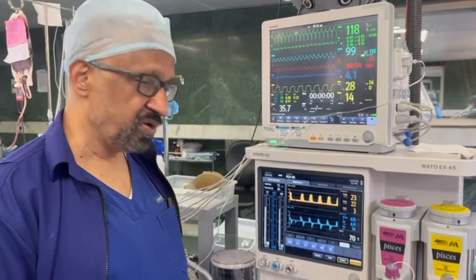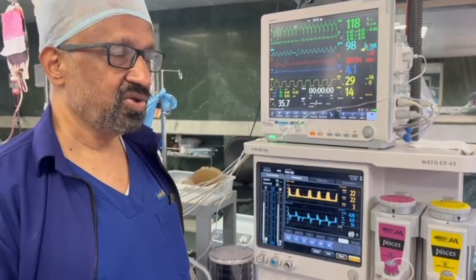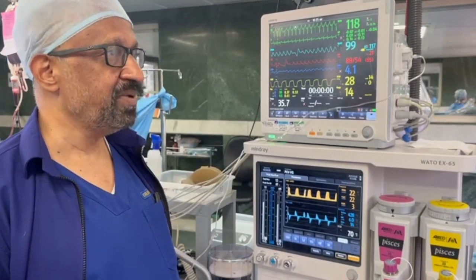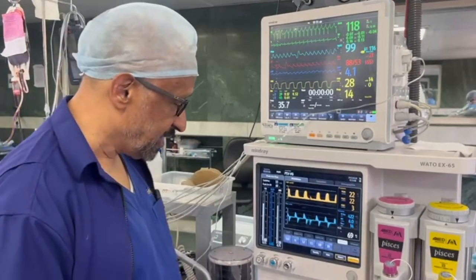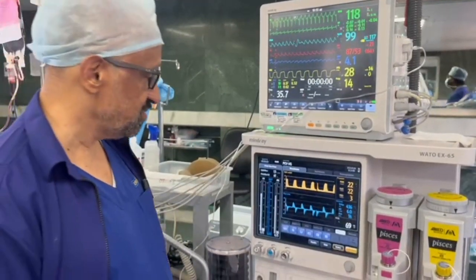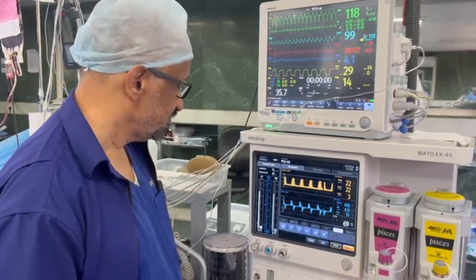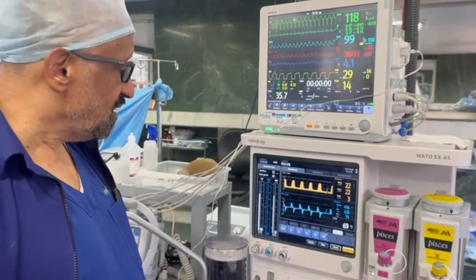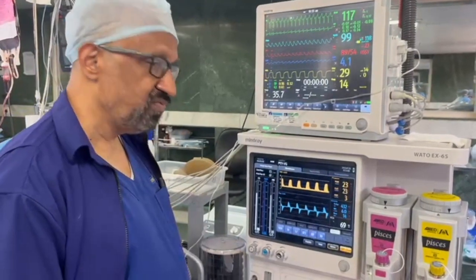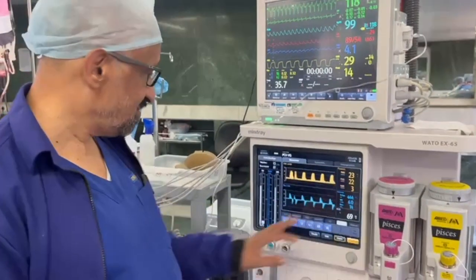Patients who undergo intra-abdominal, intrathoracic, cardiac, neurosurgical procedures and any patient who is critically ill undergoing a high-risk procedure need mechanical ventilation during the course of the anesthetic management. What are the parameters we look at when we adjust the ventilator? Some of them are exhibited on the screen here.